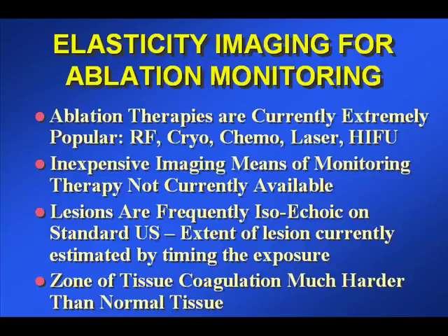Ablation monitoring I've already mentioned. There are many ablation therapies available, including radiofrequency, cryoablation, chemo, laser, and high-intensity focused ultrasound. All of these produce increased tissue stiffness, which should be imageable using elastographic imaging. An inexpensive means of monitoring therapy is not currently available.